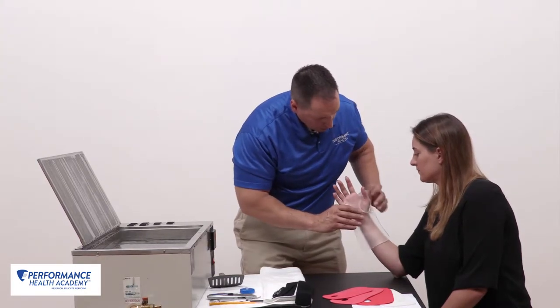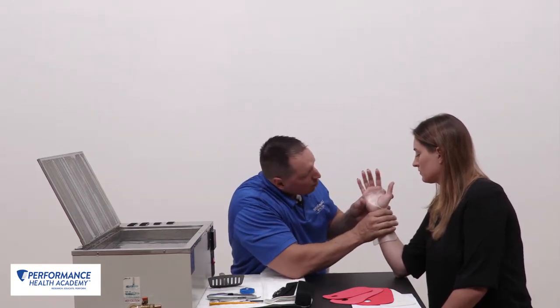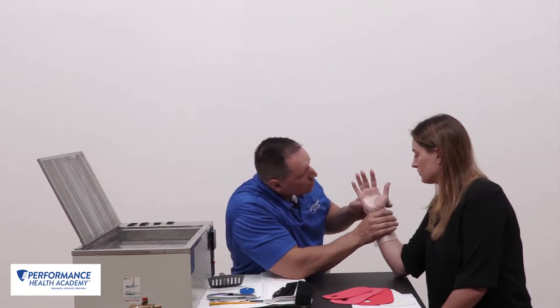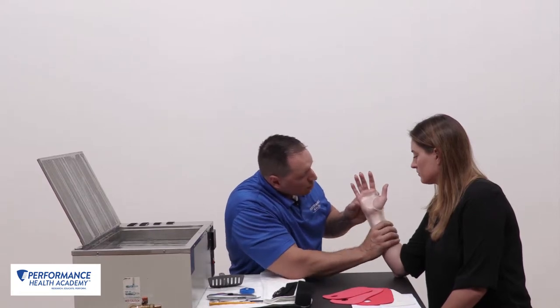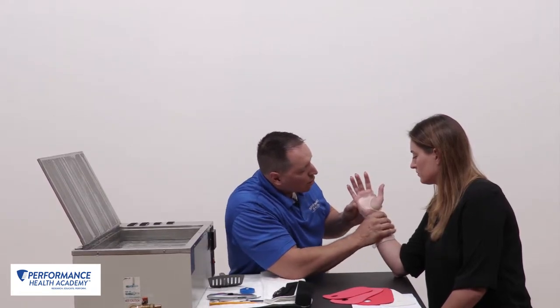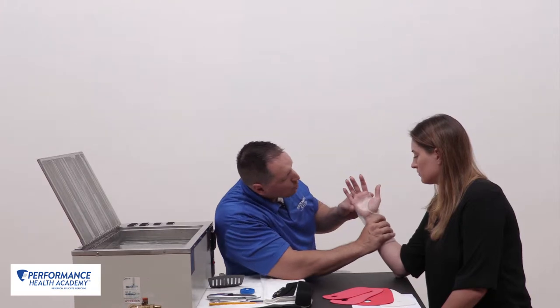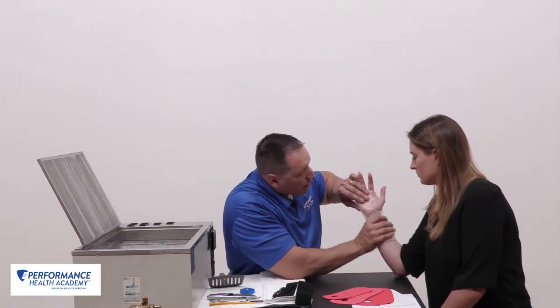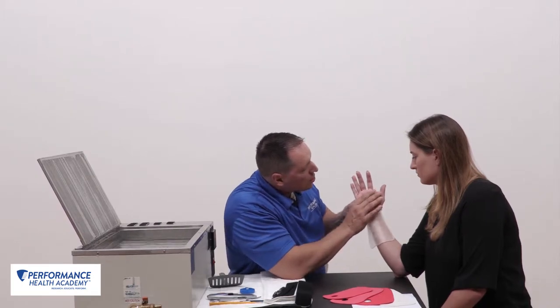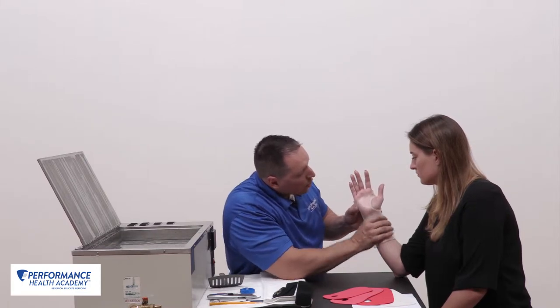I check if it's too warm, then apply that material and begin to conform and gently caress the material following the creases and the position I want the patient in. You can use gravity or an ace bandage or any kind of wrap to help. I bring my thumb around to stretch out the material, constantly monitoring as it may contract slightly. The key is to make sure it conforms to the creases and arches for a nice, custom, comfortable fit.